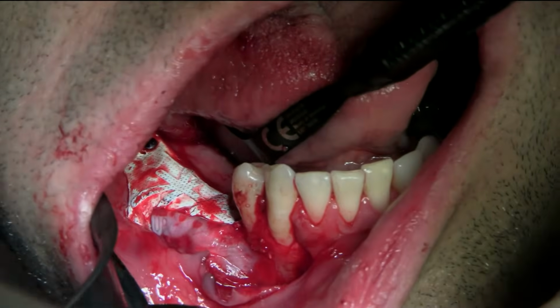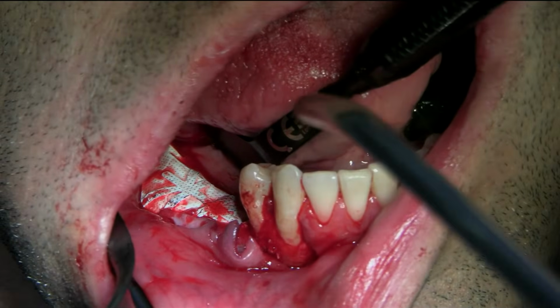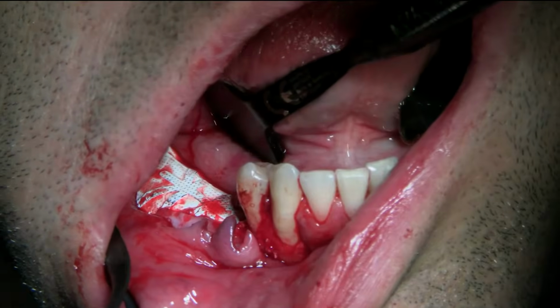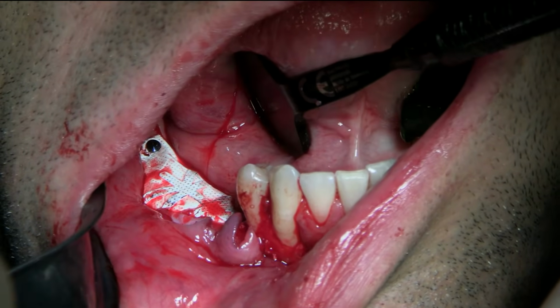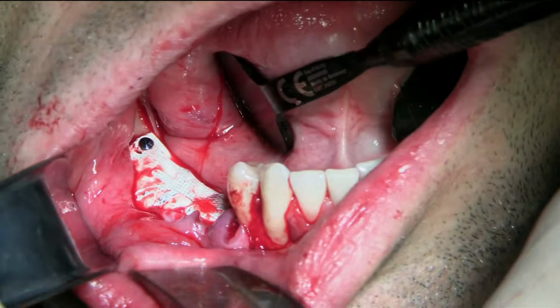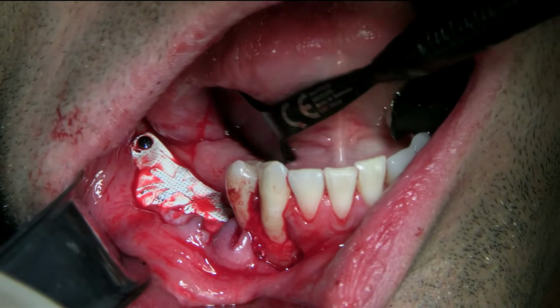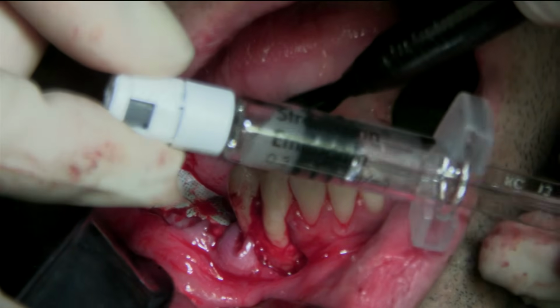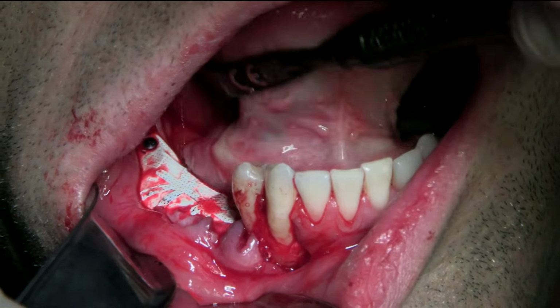Okay. So now suction the distal of the membrane. Anterior or posterior? Posterior, but don't suction the BioGuide. So posterior, posterior. Okay. So, okay, ready? Hold this one, just the cheek here. These two, okay, but the cheek, okay? That's good. Where's the Emdogain again? Okay, we have the Emdogain again. So I will inject that. I will start first to suture, but I can show you just how we want to apply that.